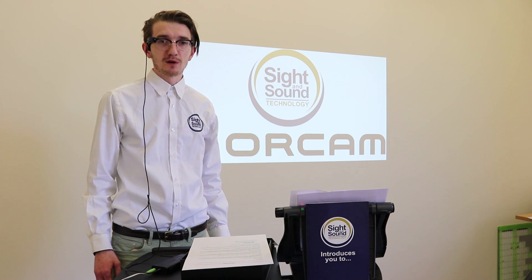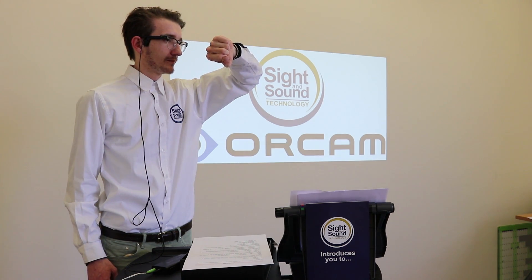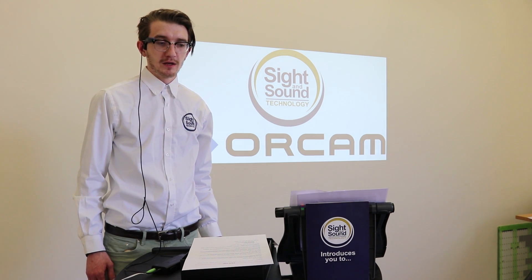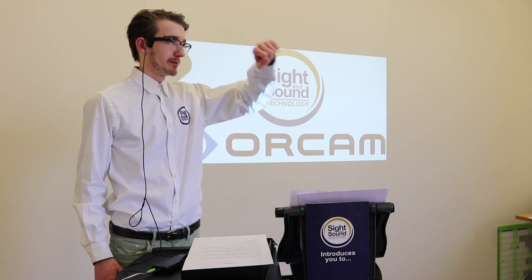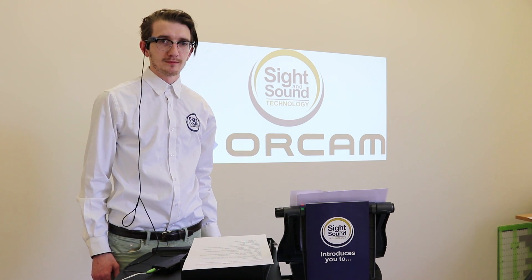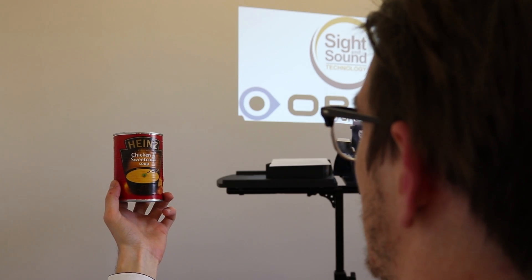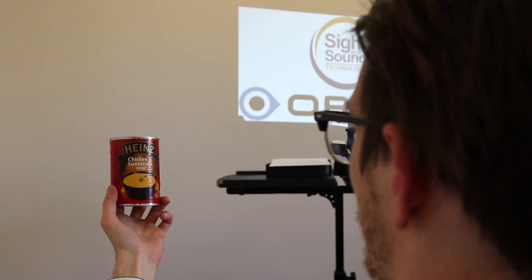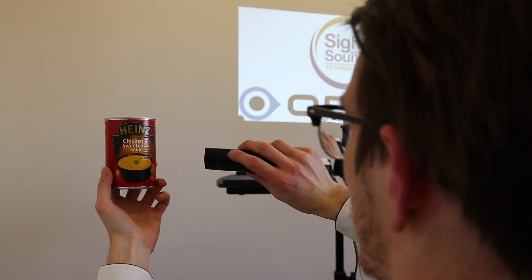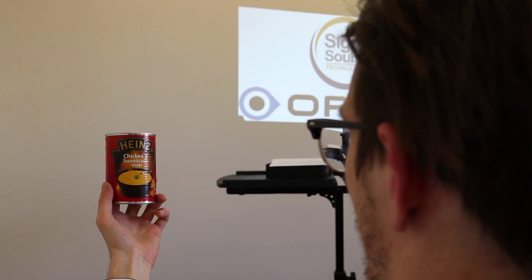You also may have noticed how when I point to a certain line or paragraph it continues reading from that bit. Another really cool feature of OrCam is if I do the gesture as if I'm reading my wristwatch it's going to tell me the time of the day. Today is Wednesday April 19th. And if you hold it for a shorter period it's just going to tell me the time. So that's a really neat feature and really handy if you're on the move.